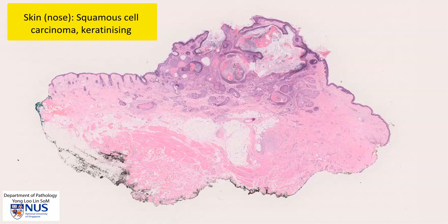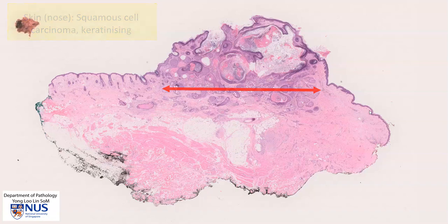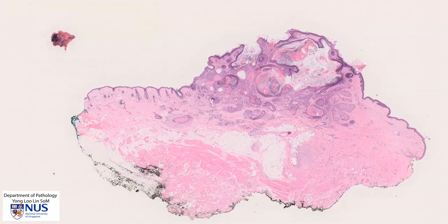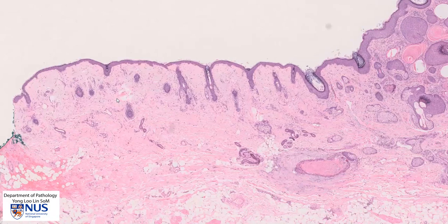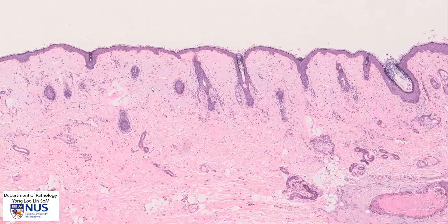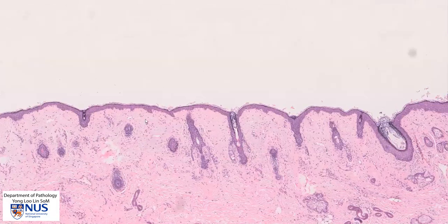The tumor actually extends from here to here, and on the right side we have some normal skin, similarly on the left side. So let's quickly orientate ourselves to the normal areas first.